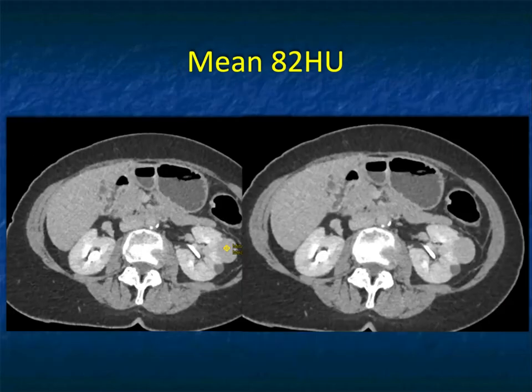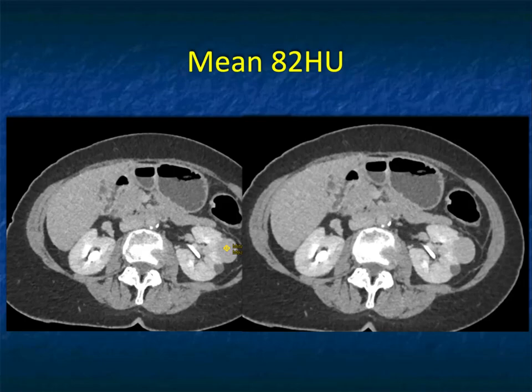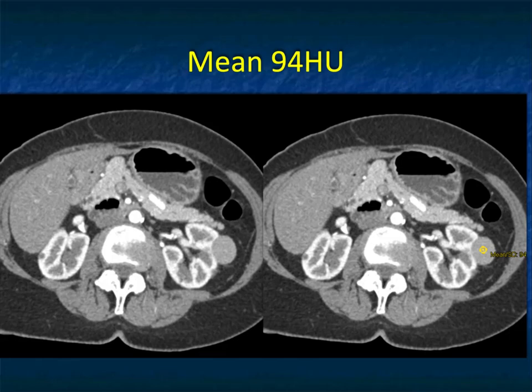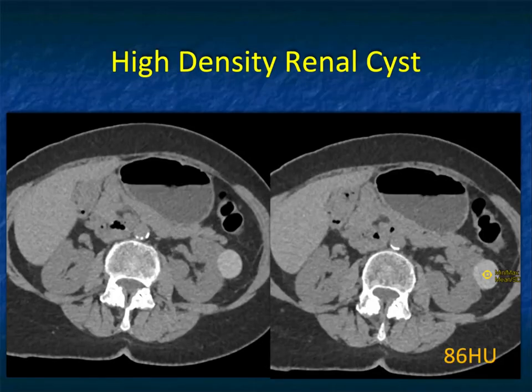It's very well-defined, and if you go to the delayed phase imaging, it's 82. So you have a mass, 2 centimeters plus, measuring in the 80 Hounsfield unit range that doesn't change. If you only looked at the excretory phase, you would say this is a solid mass, 82 Hounsfield units, likely a papillary renal cell carcinoma. If you looked only at the arterial phase, you would say there's a solid mass measuring 94, renal cell carcinoma. This is the challenge.